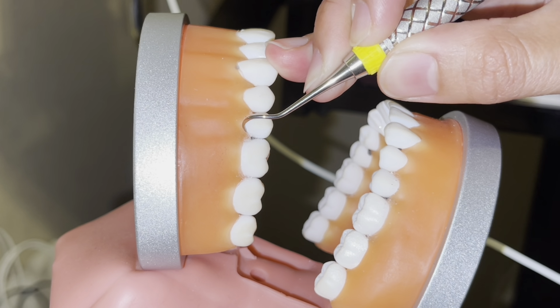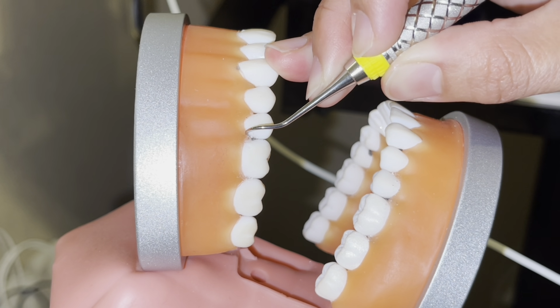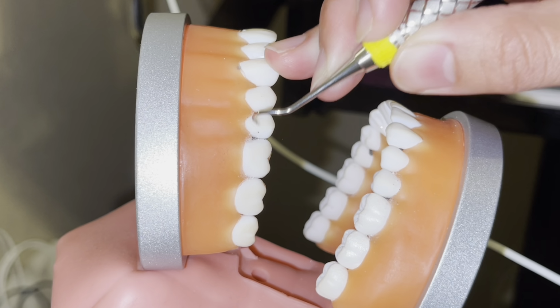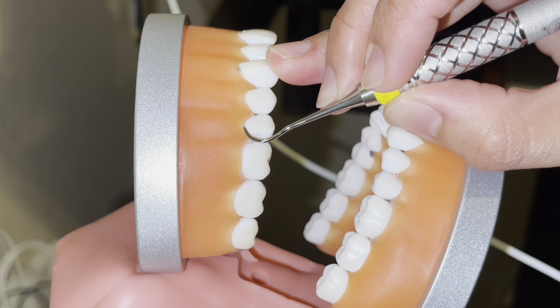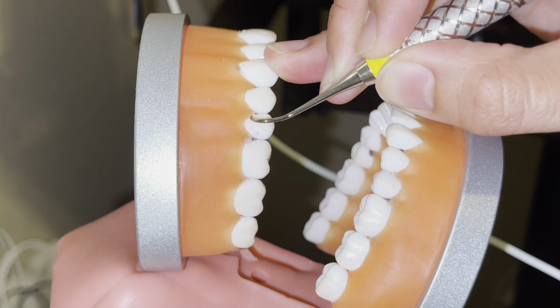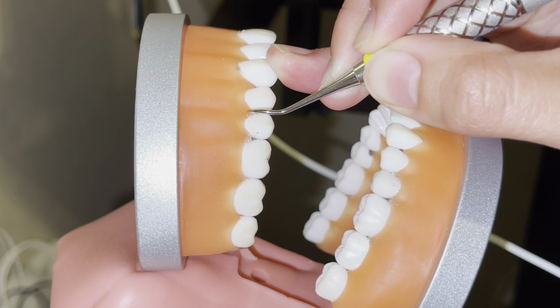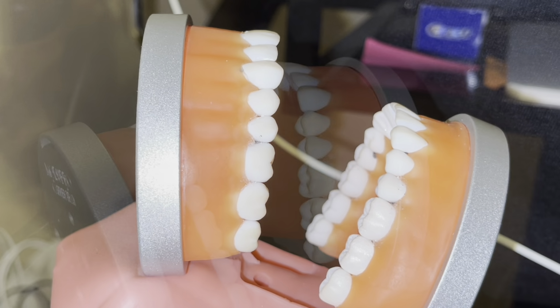We'll activate an oblique stroke, up, down, interproximal, go up, down. Turn your instrument halfway, up, down. My elbow is pivoting towards me as I move along the line angle, and in the interproximal, go up, down.